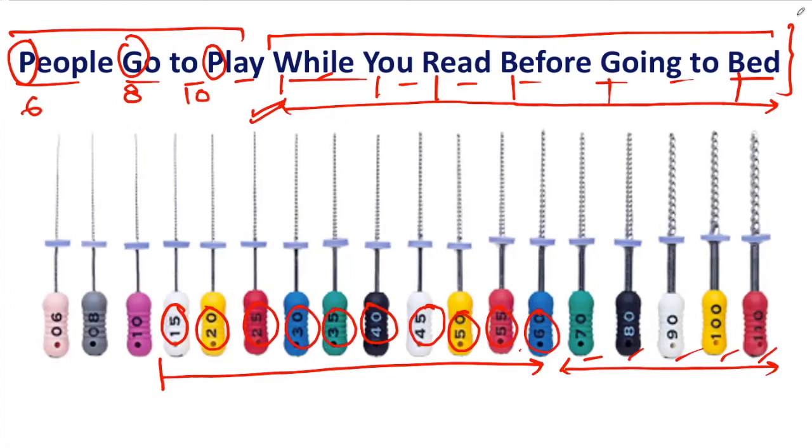Clear? So I hope these two things, that is color coding and sizes of the endodontic files, is clear to you.